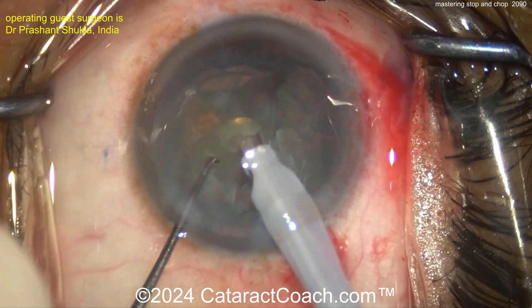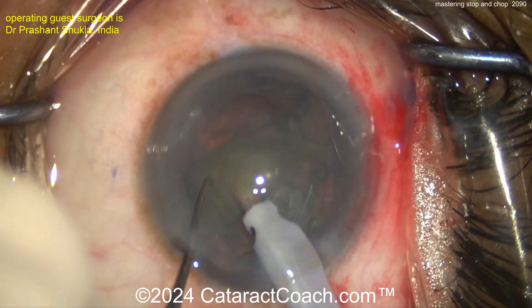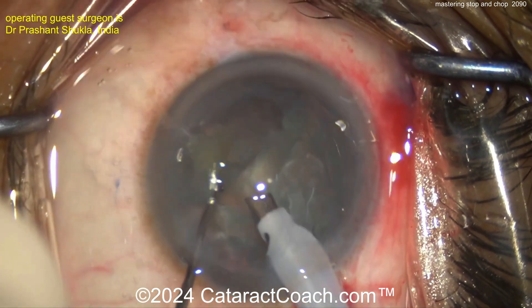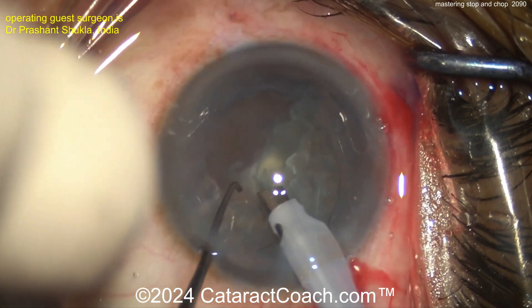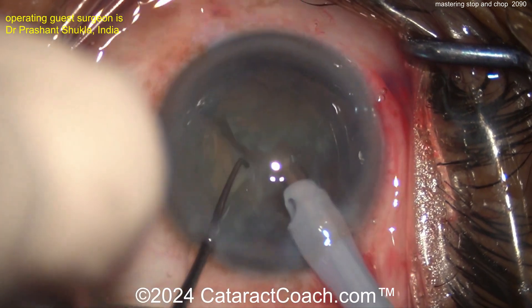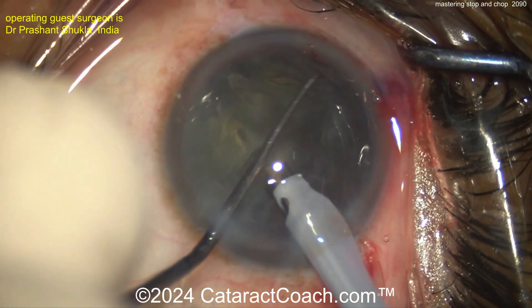Think about what settings you want for the groove. For grooving, you need some power — depending on the density of the nucleus, let's say 20% and up. You need low flow, maybe 15 to 20 cc's a minute, and relatively low vacuum, maybe 200 or less mmHg — just enough to aspirate out the pieces you're grooving. For removal of the quadrants and chopping, you need that holding power. Phaco power is probably around the same, but vacuum needs to be up — at least 300 to 400 mmHg, maybe more. Increase the flow rate to 25, 30, or even more cc's per minute so the pieces flow into the tip.